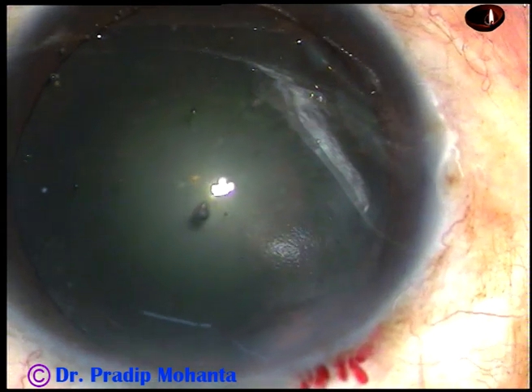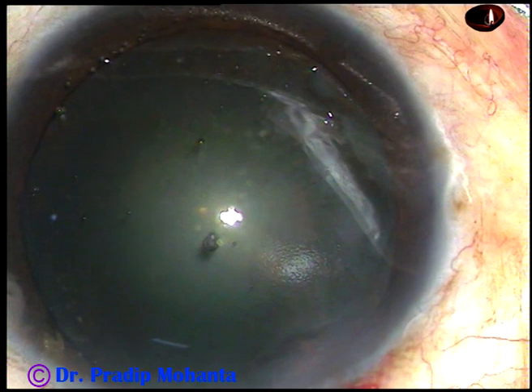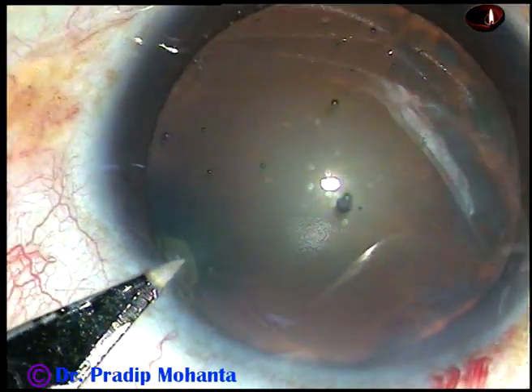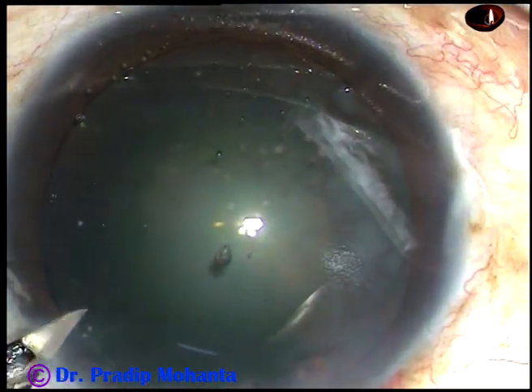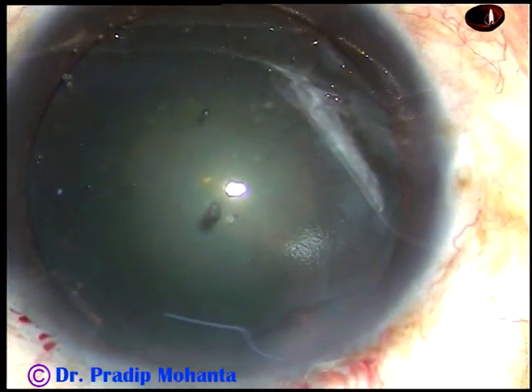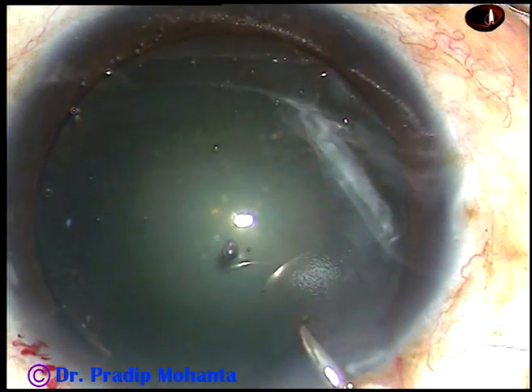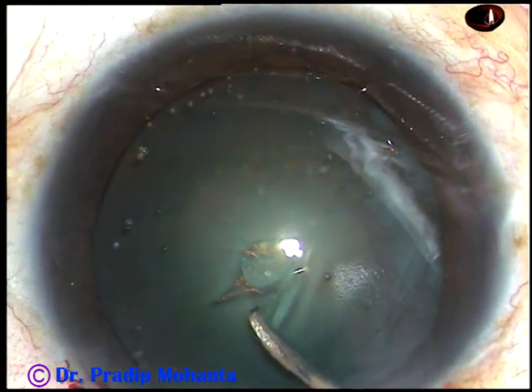Capsulorhexis is to be done. Before that, one paracentesis is done about 3 o'clock hours away from the main incision on the left side. In this case, I am going to make only one side port. Now, the anterior capsule is incised and the needle is introduced through the main incision. A capsular tag is raised.